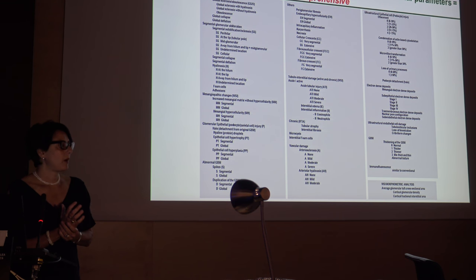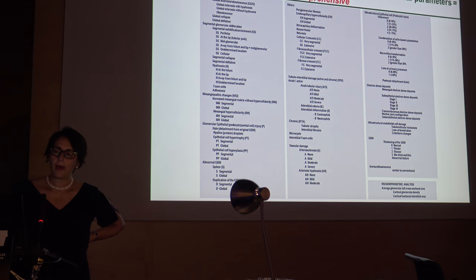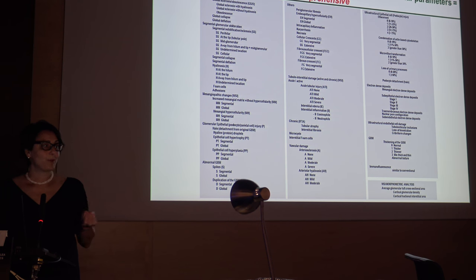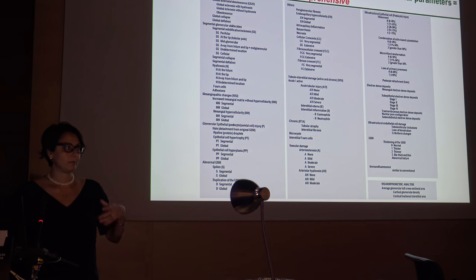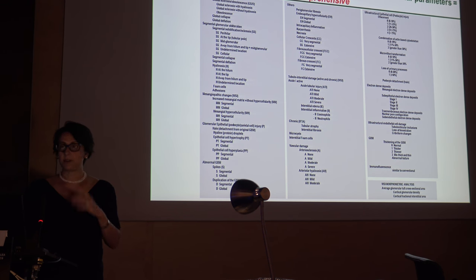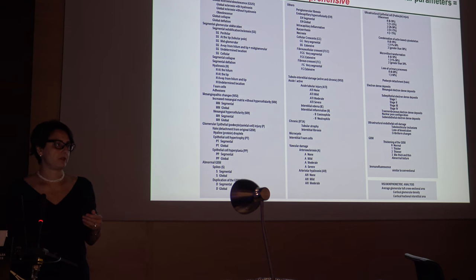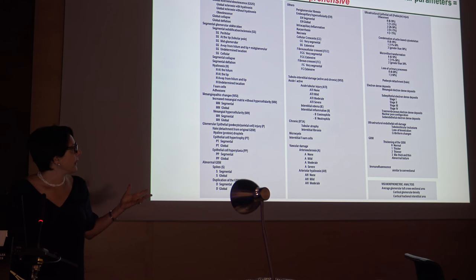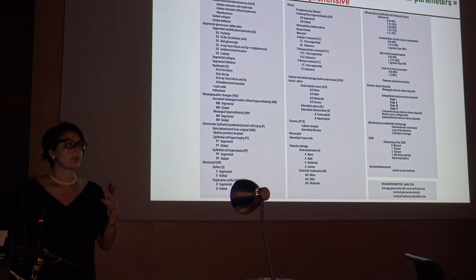This system is very comprehensive, so we have over 80 parameters that we evaluate, and those include parameters that are used conventionally by our classification systems, like the tip lesion, but also parameters that we never use, that never make it to a classification system. The presence of foam cells, for example, the presence of hyalinosis, or the presence of global sclerosis. There is not a single classification system that has global sclerosis as one of the parameters to evaluate. And also, for example, we can study the status of the endothelium, the status of the podocyte beside foot process effacement, etc.